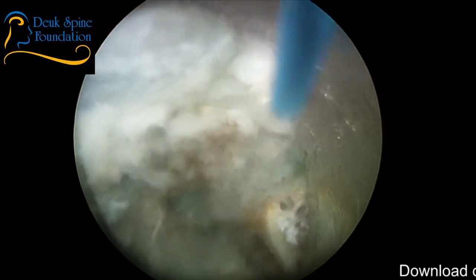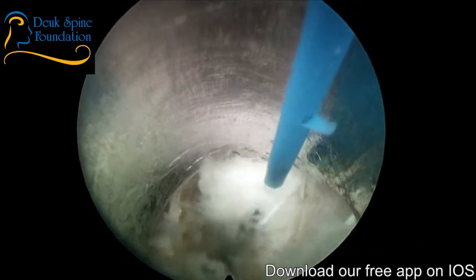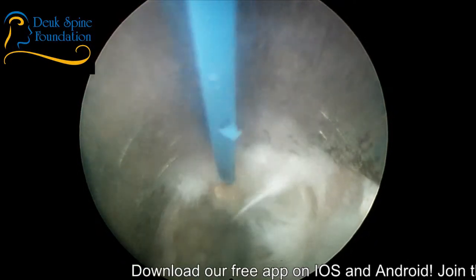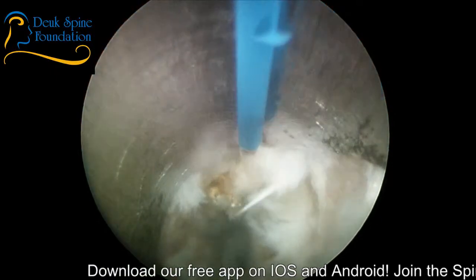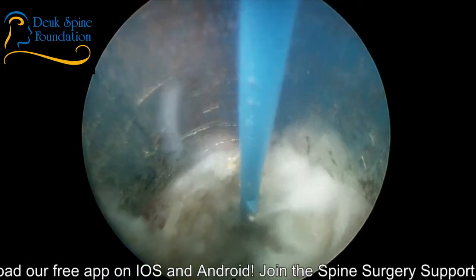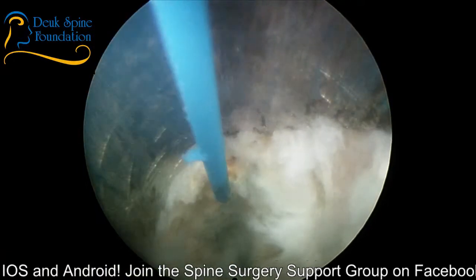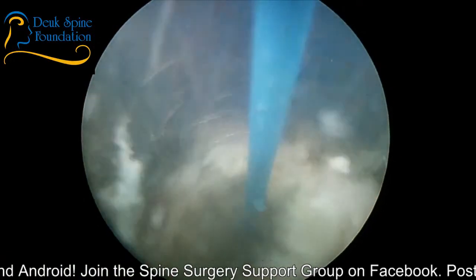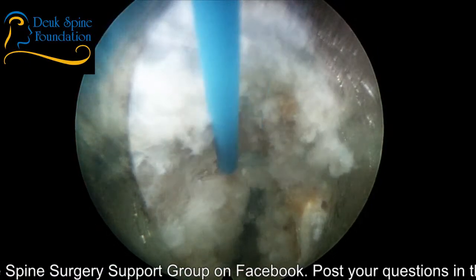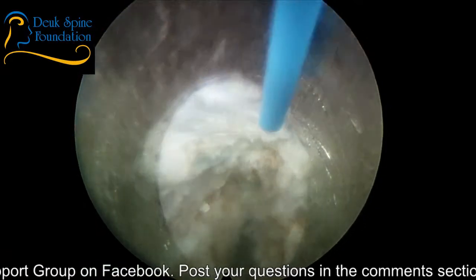I use a straight firing laser for my surgery. Some surgeons that do endoscopic spine surgery like a side firing laser — I personally have not used one and I don't like it. I've tried them out before and I don't want a side firing laser for a lot of reasons. I don't think they add anything. Clearly, I've had very good results with a straight firing laser.